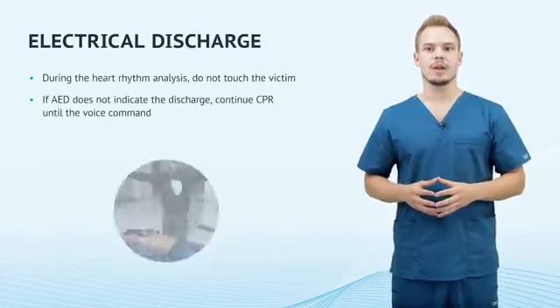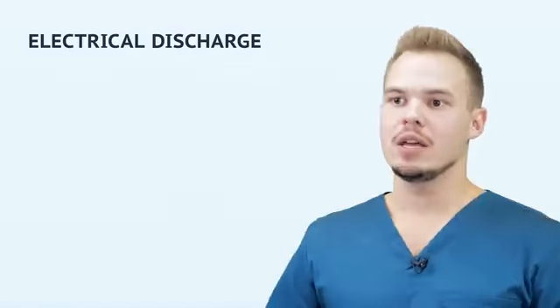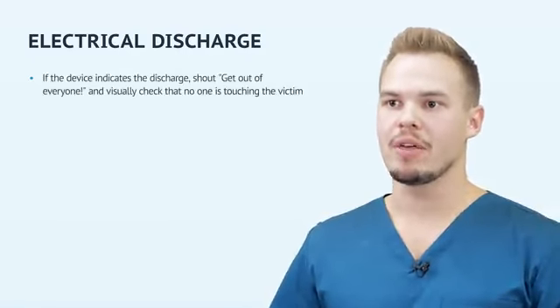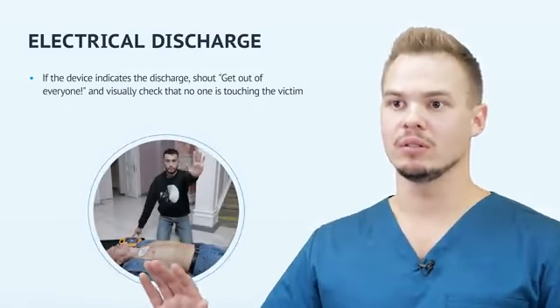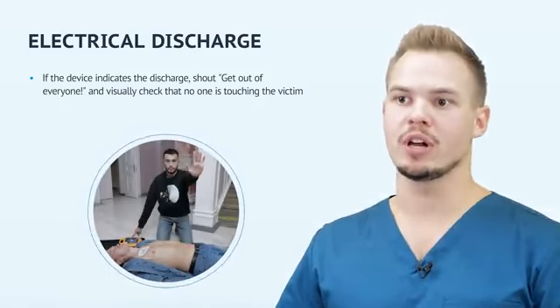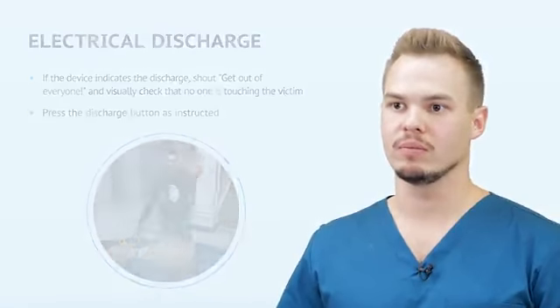During the heart rhythm analysis, do not touch the victim and make sure that no one around reaches him. If the device has counted the rhythm and the application of the discharge is shown, shout, "Step aside, everyone," and visually check that no one is touching the victim. Press the discharge button as instructed.